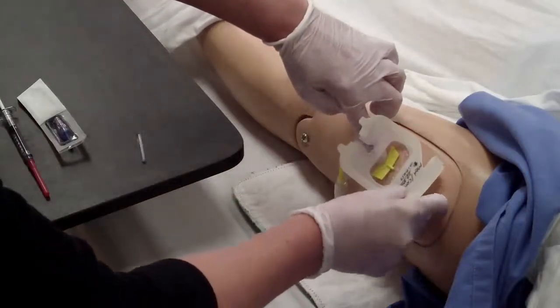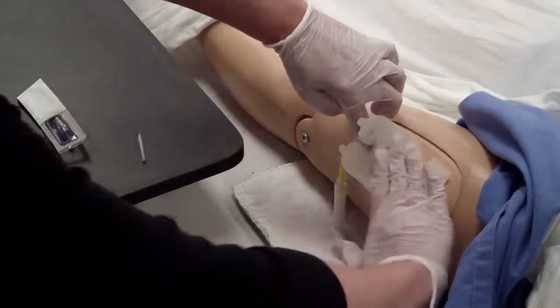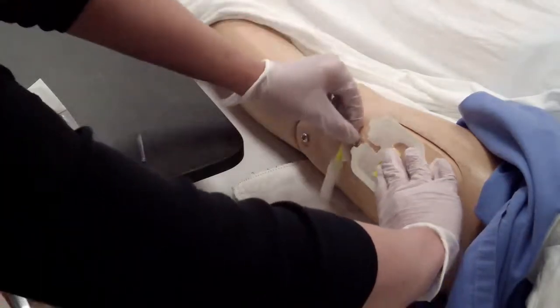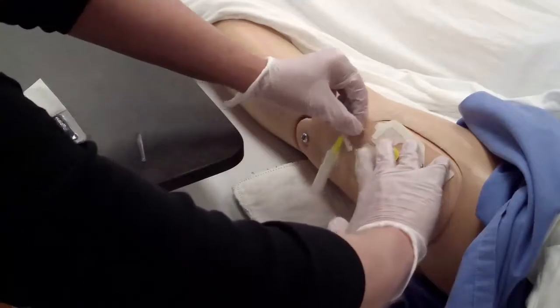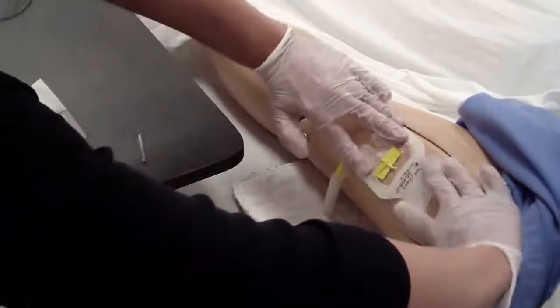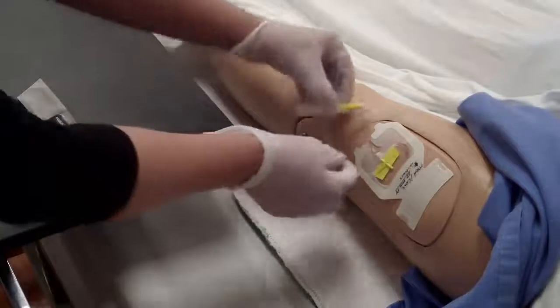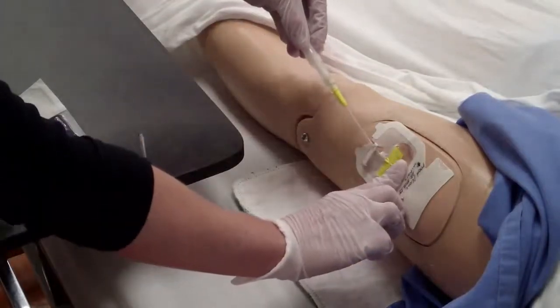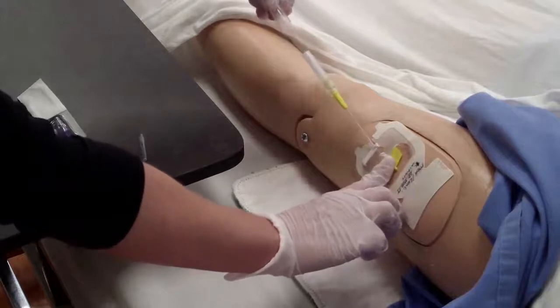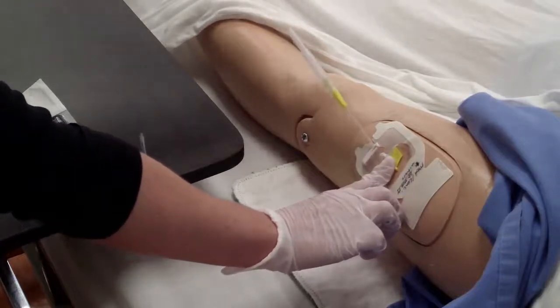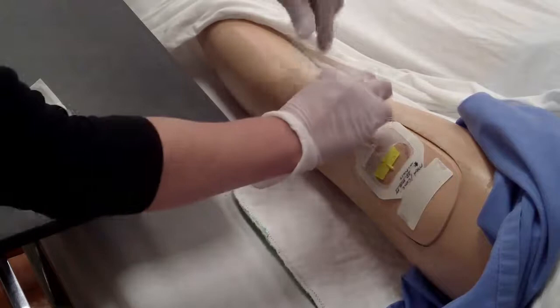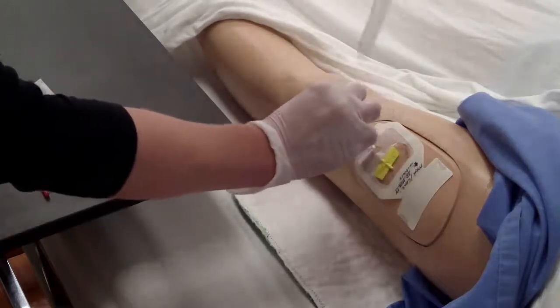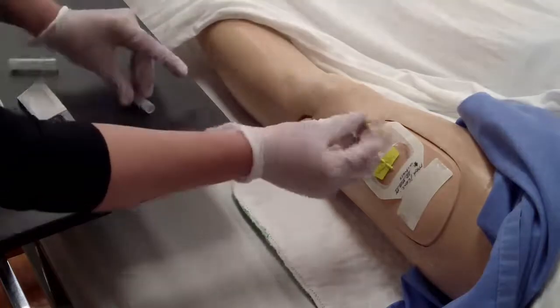Ensure that you can see the insertion site through the window of the Tegaderm. You can now remove the guide wire. Apply some gentle pressure at the insertion site and gently and slowly pull the guide wire out of the butterfly. The needle ends up in the safety barrel.